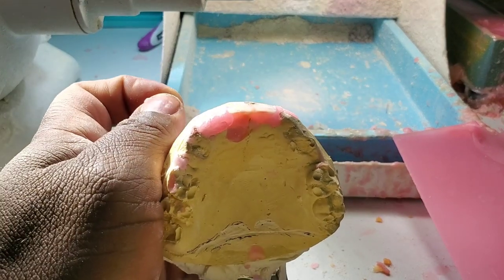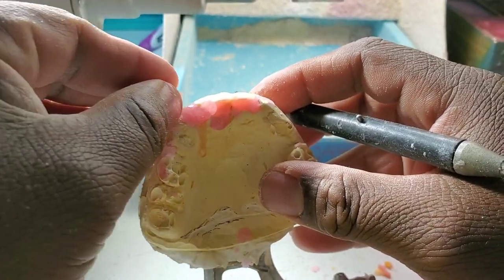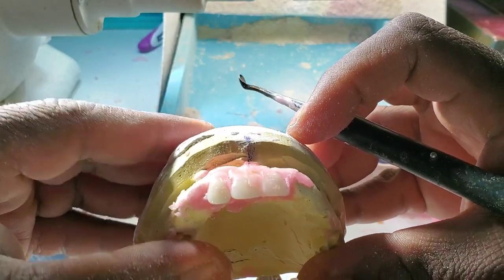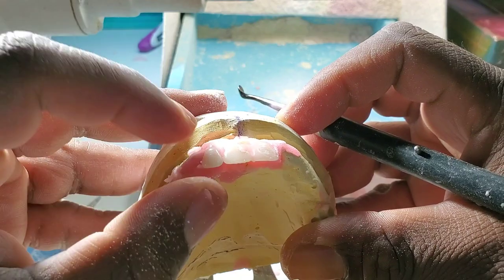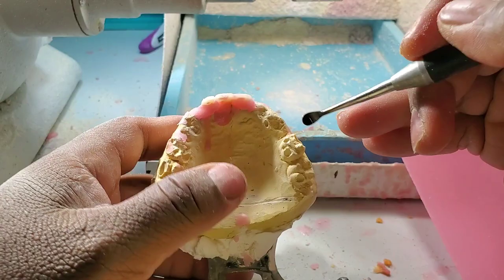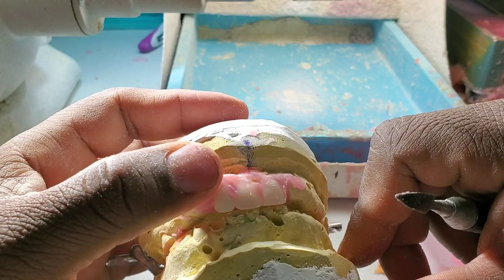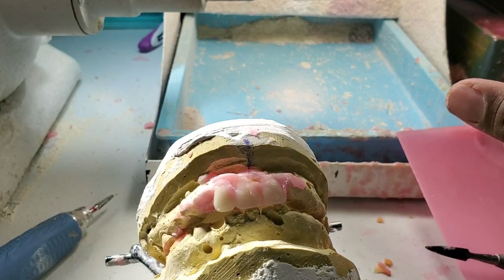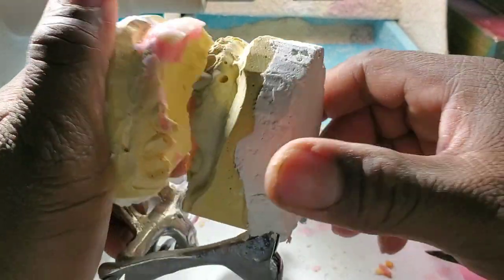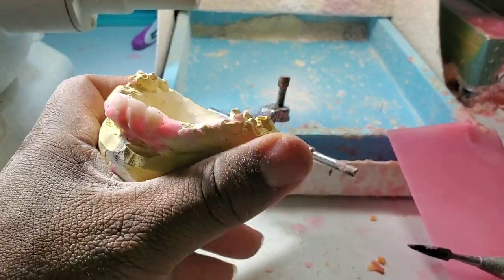You continue with the next tooth, your laterals. Either you want them straight or you want them to look more natural. I like my setups to look more natural. So what I do here is grind all the teeth out so I can continue putting every tooth into this top denture.